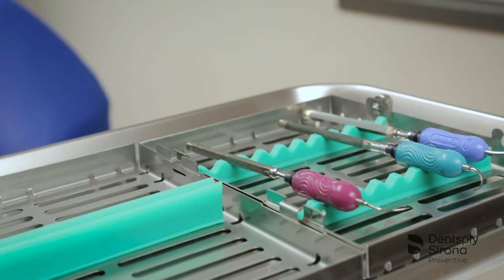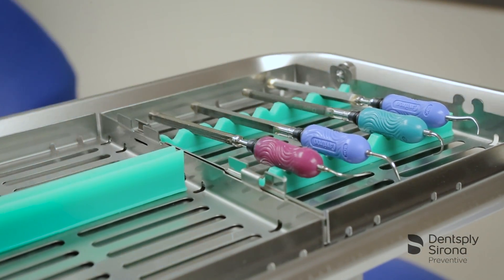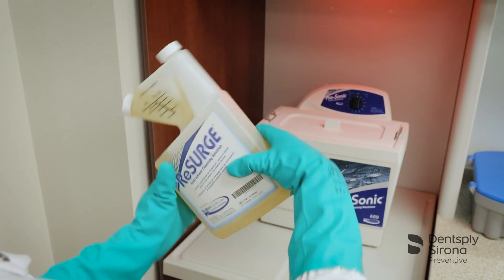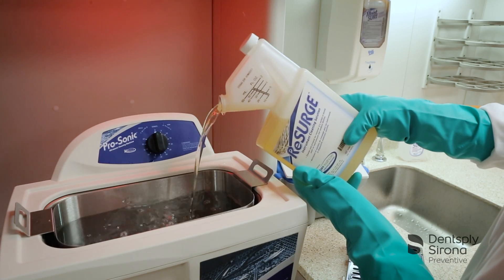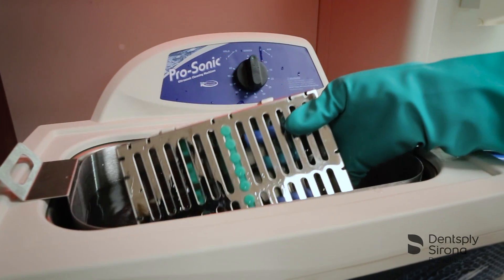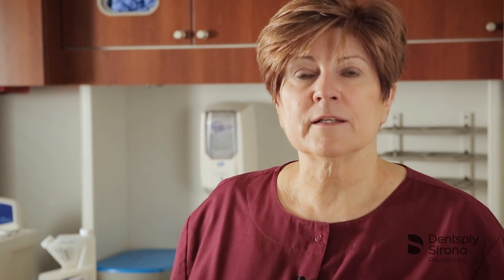To effectively clean Cavitron inserts, Dentsply Sirona recommends putting your Cavitron inserts in a cassette and using Resurge instrument cleaning solution in an ultrasonic bath. Resurge solution is an enzymatic cleaner that is neutral pH, biodegradable, and environmentally friendly. Resurge solution has been tested and is confirmed to have compatibility with Cavitron ultrasonic inserts.